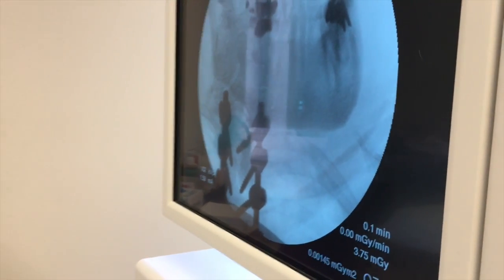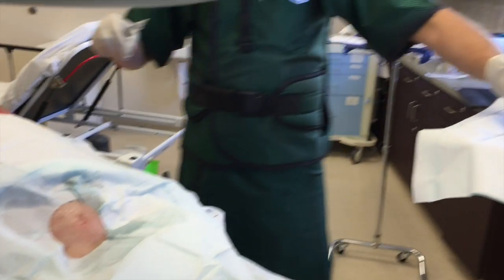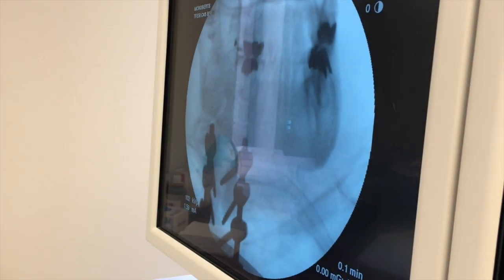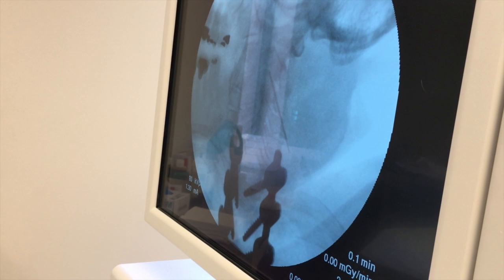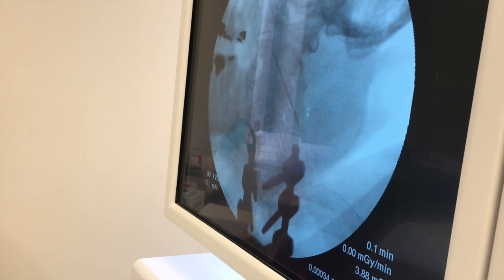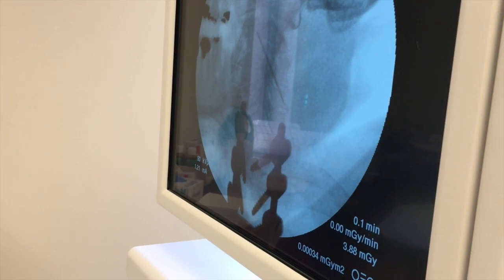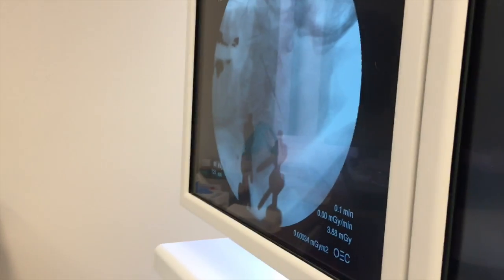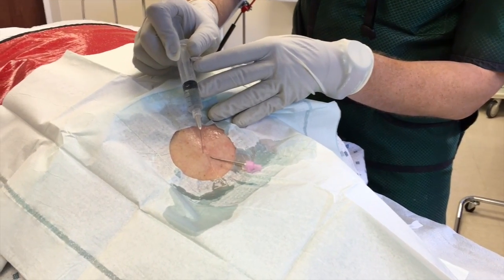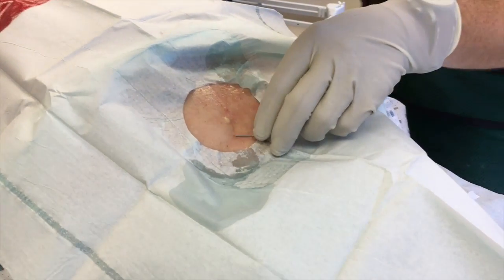Let's have you turn your head now to the left side and we'll go after the right. By turning to the other side, it shows off the anatomy very clearly and also protects the vertebral artery from our presence, which is key to making this safe. How many times can you repeat this procedure before you say no more? Well, that's a good question. Generally we try and have as few as possible. Three in a six-month period is the most. I really like to keep it at two. Six in a year would be the most that most people would do. It depends on how much steroid you use, and we don't use a ton of steroid — and that's key.